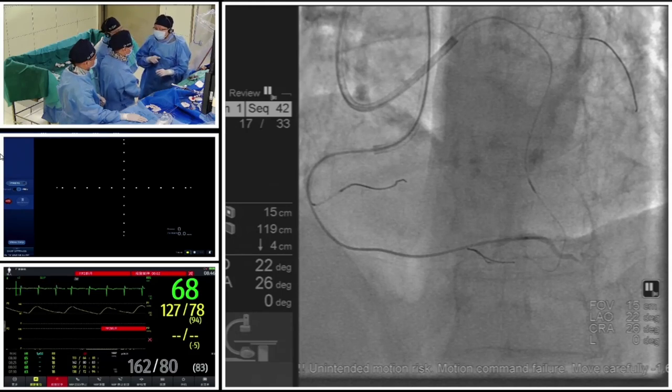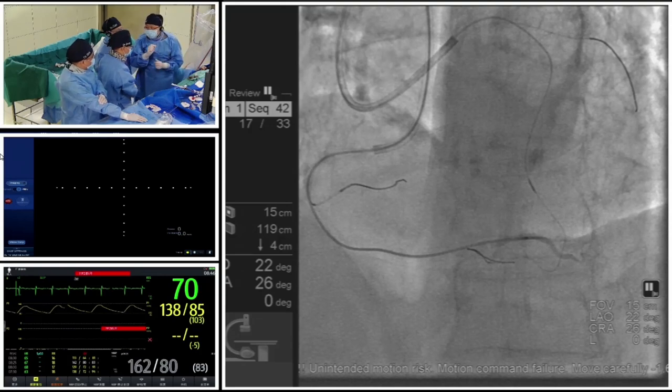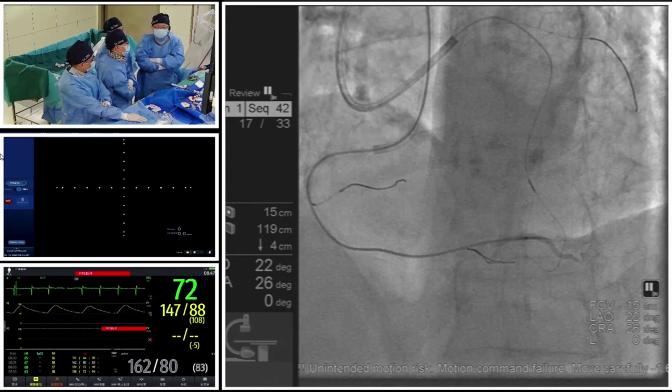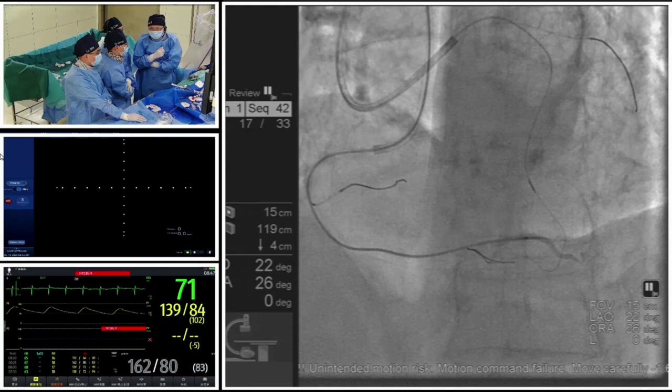So very precise puncture because we have the IVUS. From different views, we do angiogram to show us where is the ostium. And certainly for that kind of case, hybrid is very important. If we could use the ipsilateral collateral channel or the contralateral collateral channel, for that kind of case it may increase the success rate. But very unlucky for this case, the small old lady, the ipsilateral collateral channel and septal collateral channel are not very good.